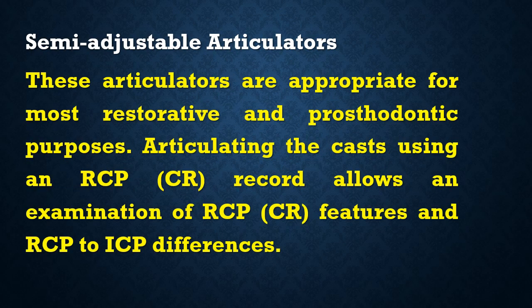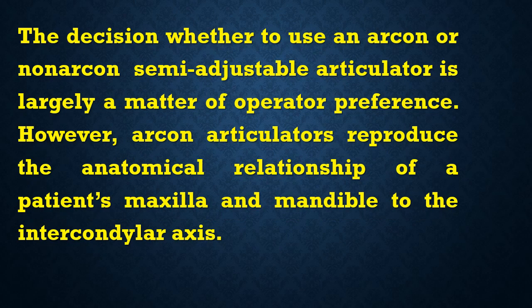Well, the semi-adjustable articulators are the most popular ones for restorative and prosthodontic purposes. Articulating the casts using the RCP centric record allows an examination of retruded contact position features, and also you could examine the RCP to ICP, which means the difference between centric relation and centric occlusion.